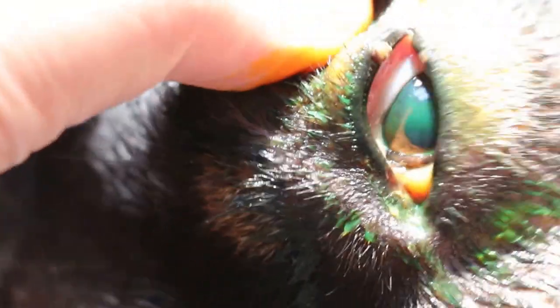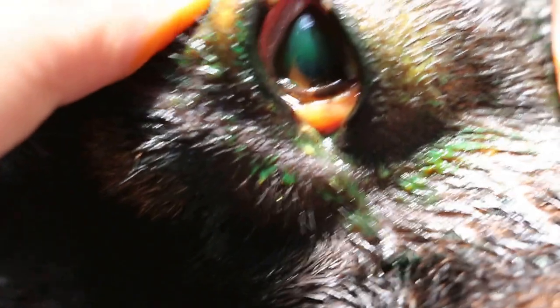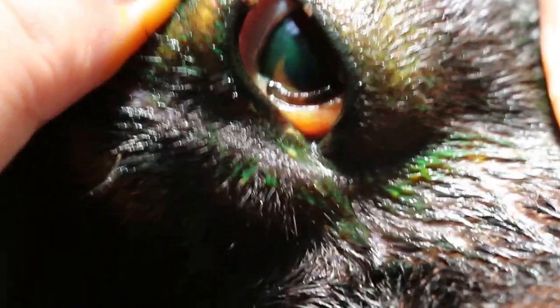Just don't touch the upper eyelid. That's the lower eyelid. Okay, you put the lower eyelid — you do the lower eyelid, don't touch the upper eyelid. You can see the green also there. Normally it shouldn't be green. You can see it's green now. The green also is there, it's quite a big one.